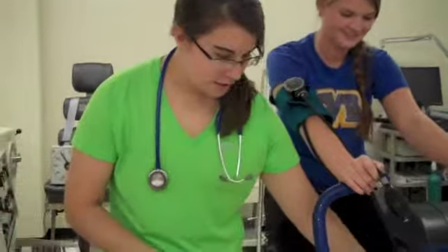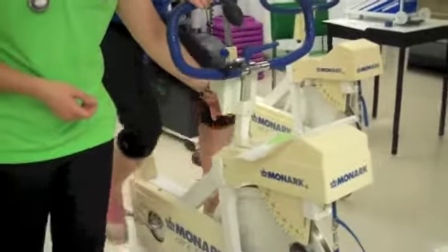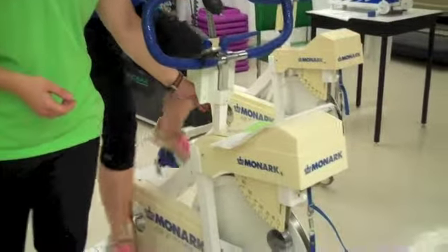Ashley's heart rate is now 162, so she has met 70% of her heart rate reserve, and so we will now terminate the test. I will decrease the workload back to 0. Ashley, keep pedaling. Ashley is now going to do a cool down for 2 to 3 minutes.